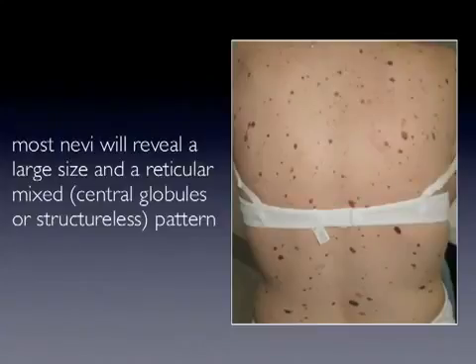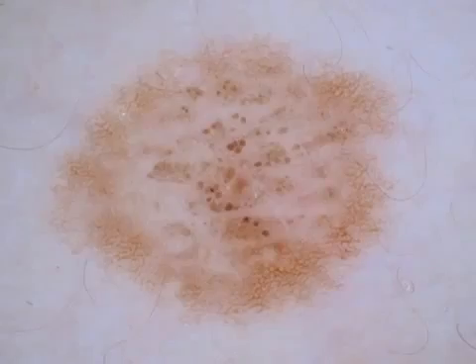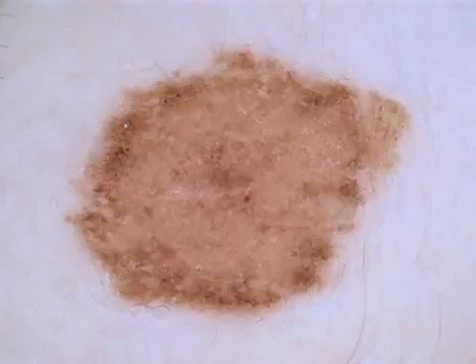On the other hand, most nevi in a person with multiple large nevi will show a large size and a reticular mixed pattern composed of central globules or structureless areas and a peripheral network. Here is one example: central globules surrounded by a network. Another example shows a more structureless brown pattern, but still we can recognize at the periphery a reticular pattern.